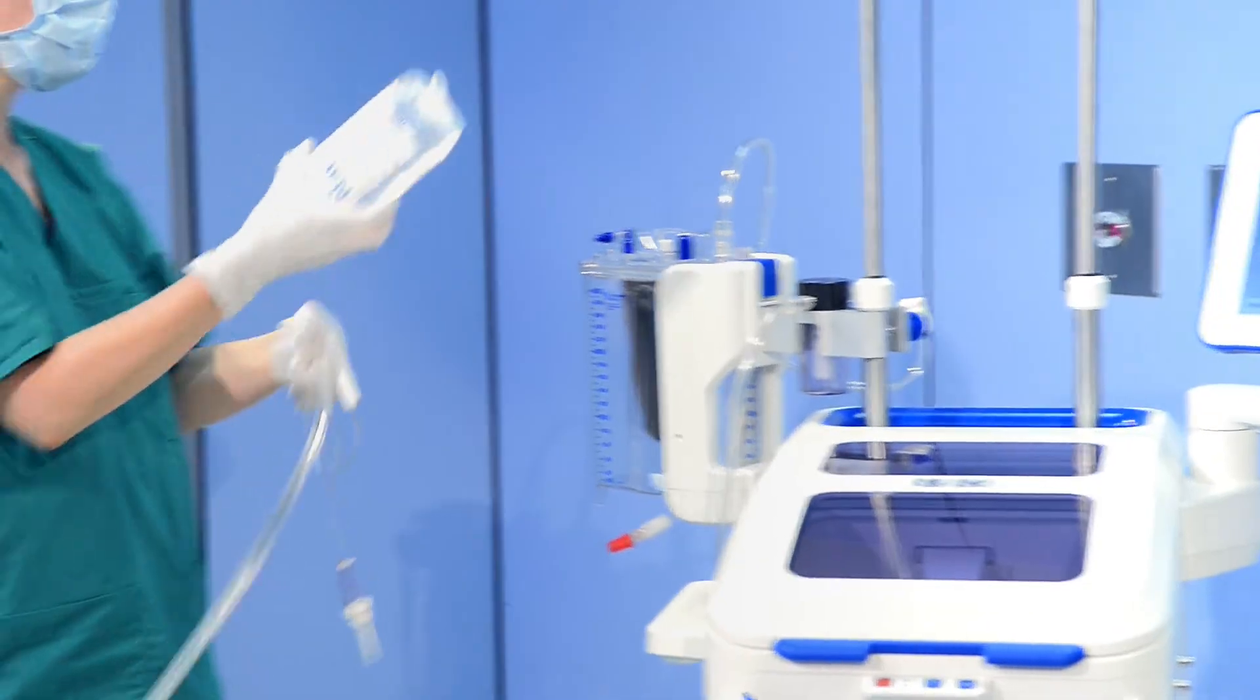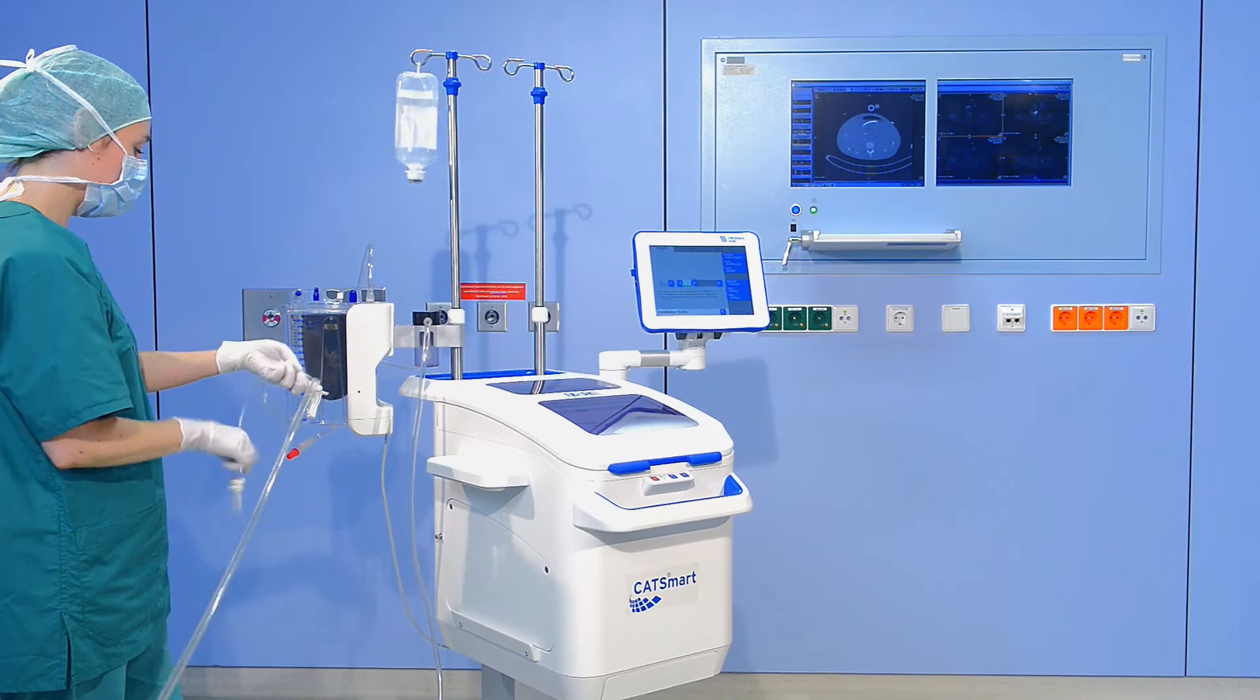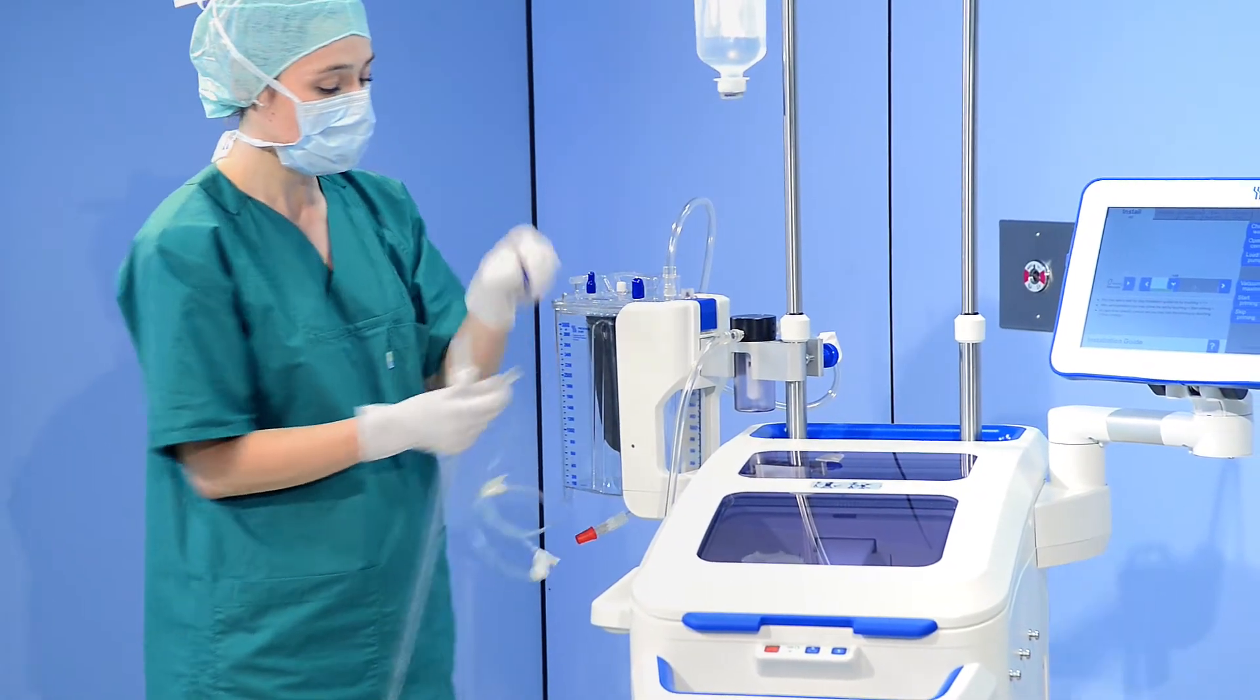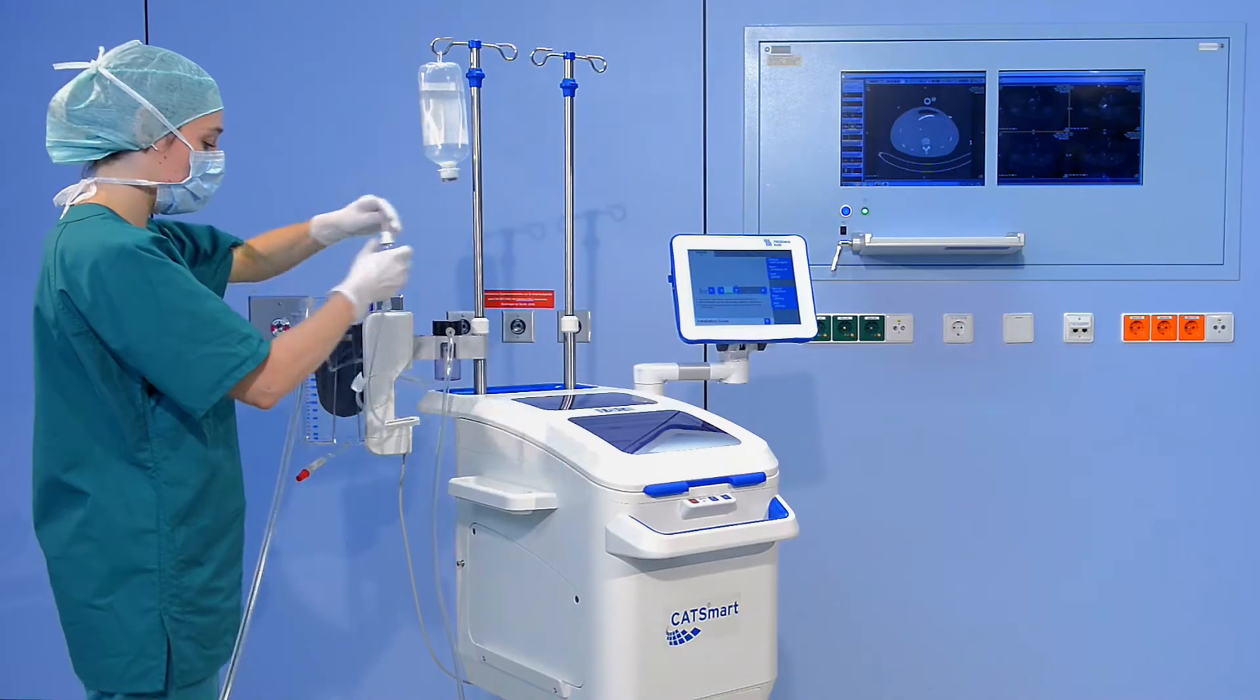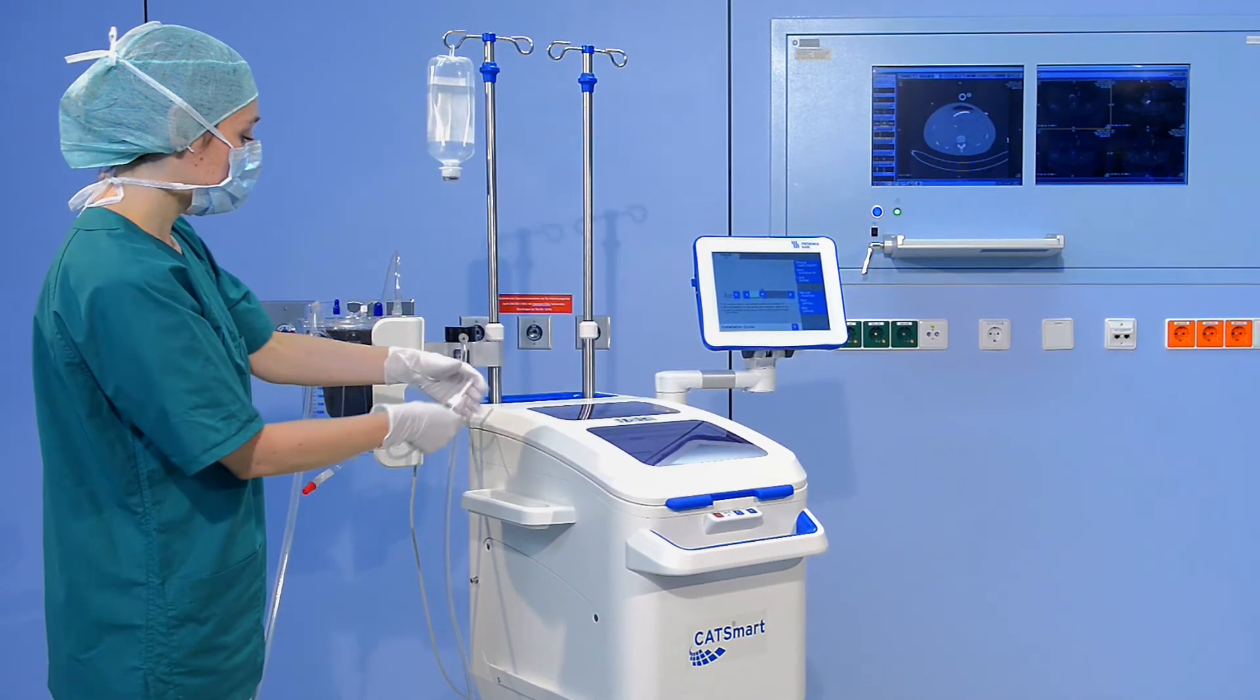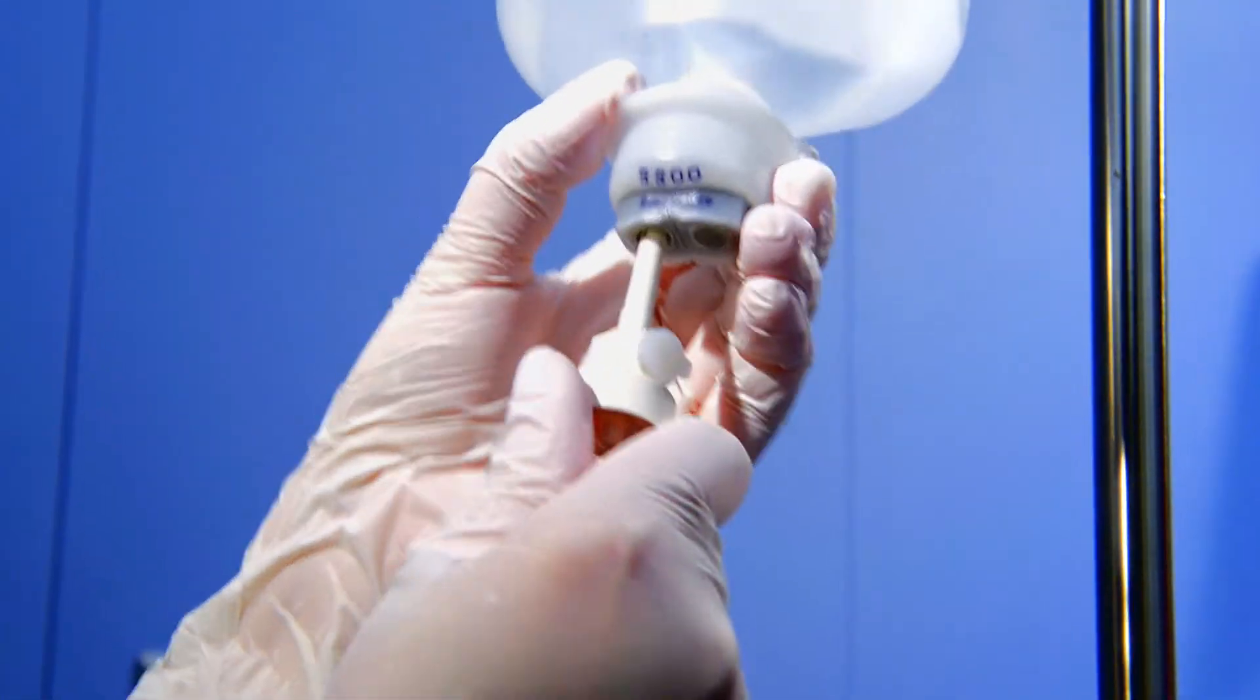Prepare 30,000 units heparin per 1 liter of isotonic saline solution. Connect the adapter to one of the reservoir ports, blue cap. Connect the drip chamber to anticoagulant solution bag using the spike.